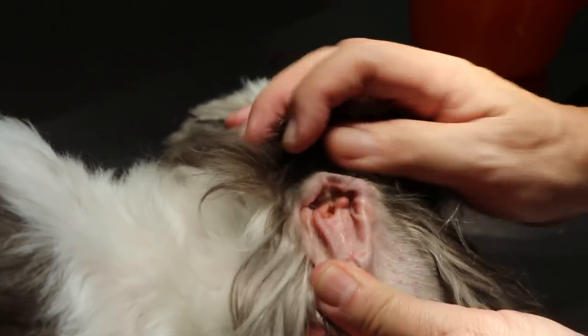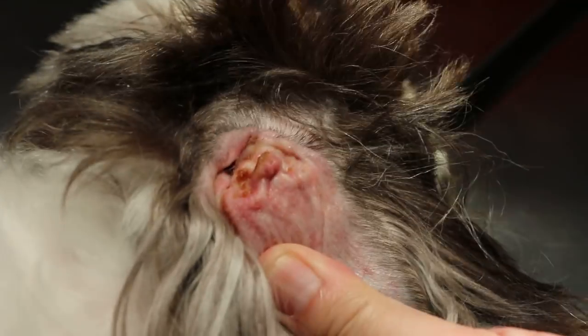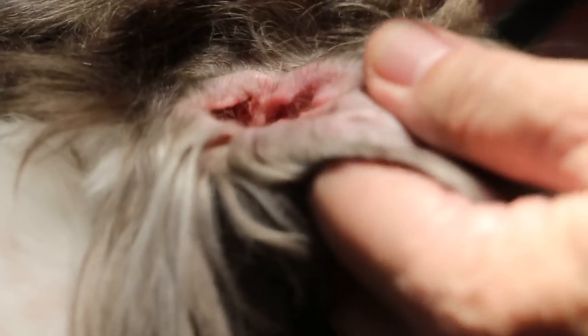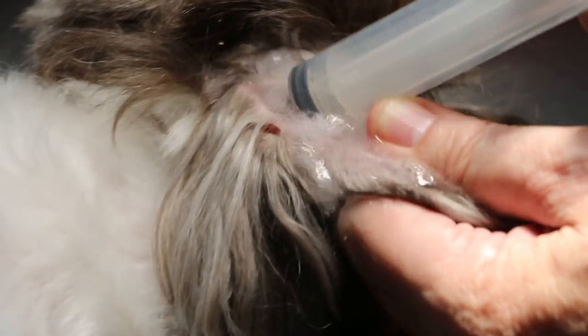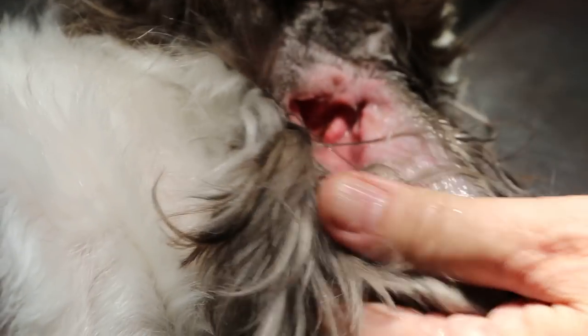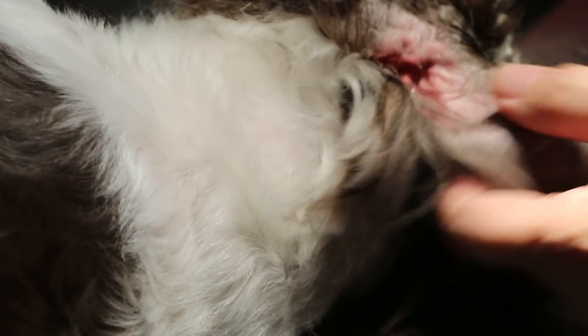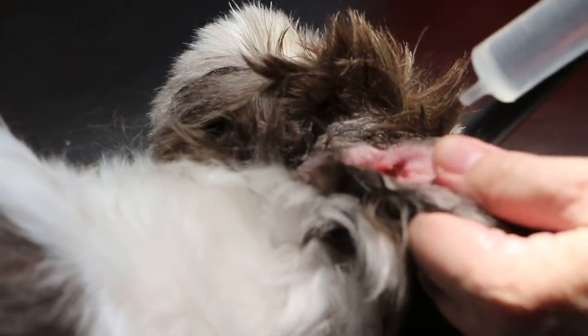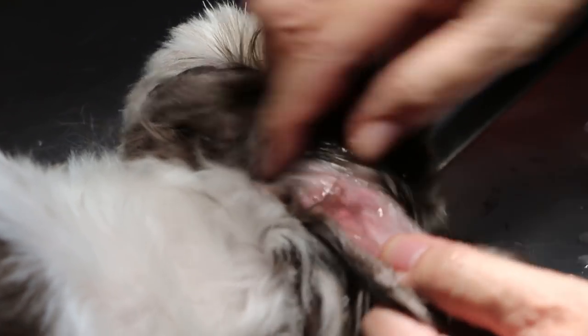Now you can see there's some earwax as well. Normally I'll do 45 degrees, then massage. Without sedation it's very difficult to do. Let's see — 45 degrees — the ear canal is here, this is the vertical canal. At 45 degrees, not too close — if it's too close there's no space for the wax to come out.